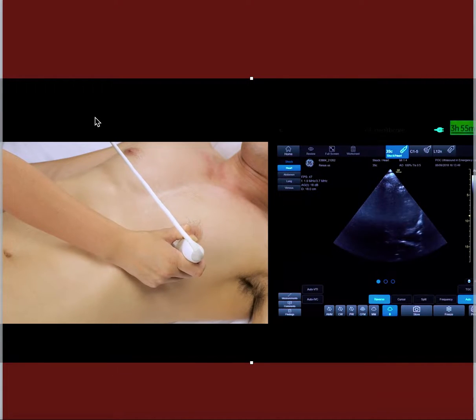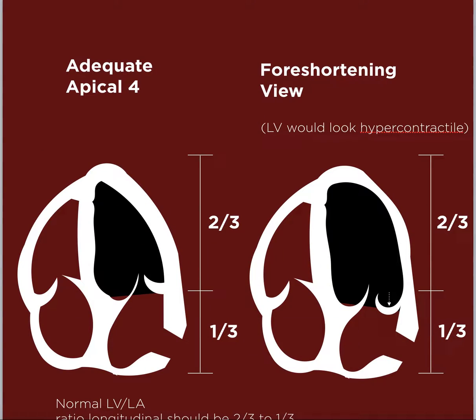In the apical four-chamber view, the most important thing is not to get a false view. The adequate apical four-chamber would have a pointy end — this is called a bullet-shaped LV. The ratio of LV to LA should be 2 to 1.